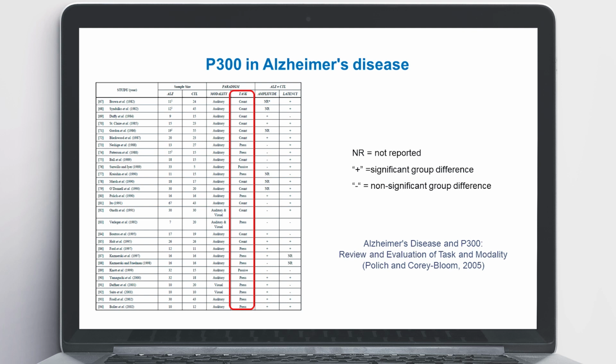To evaluate Alzheimer's disease impairment, they first employed the P300 paradigm in which patients were required to count rare target stimuli. However, the paradigm in which the appearance of the target stimuli must be marked by pushing a button proved to be more effective because, in this case, only those epochs in which the patient correctly responded to the appearance of stimuli can be analyzed.